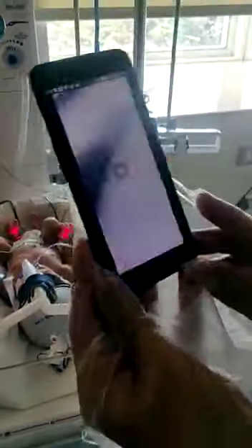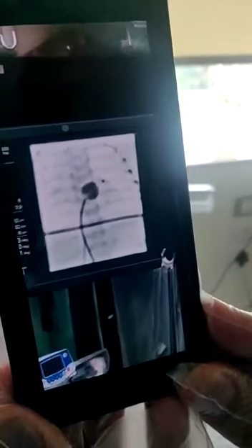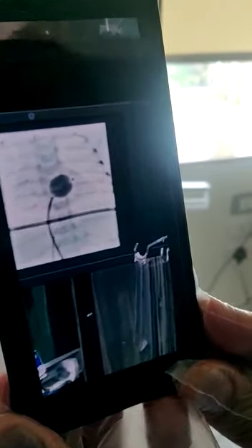As you see here, you can appreciate the process — the balloon being inflated and then pulled across the atrial septum. The balloon atrial septostomy was performed, and you can see how the flow starts moving between the atrial chambers.